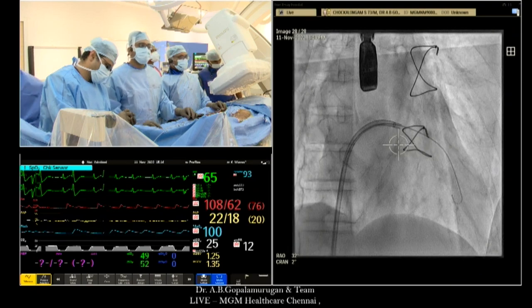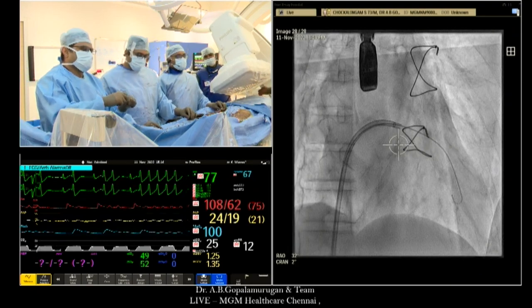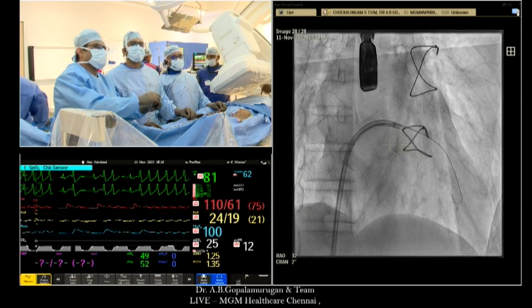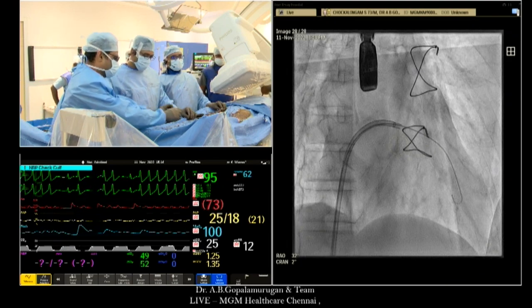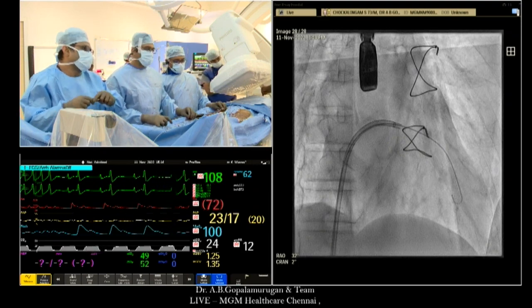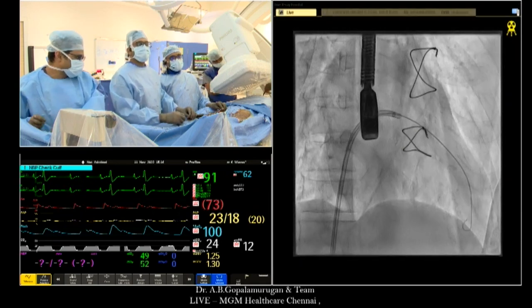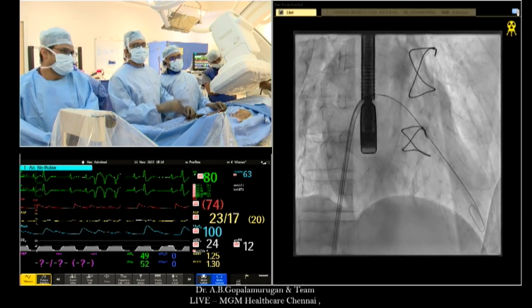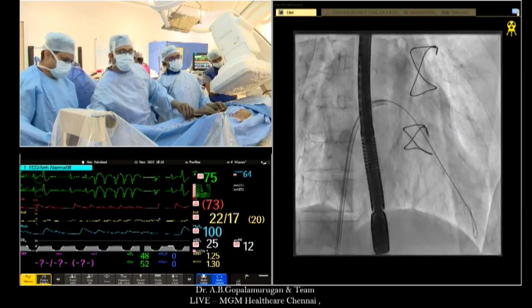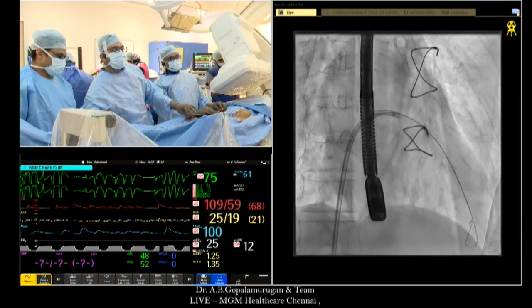And future will be hologram. We are talking about hologram and fusion imaging. So on the CT scan, if you have a GE machine and the GE cath lab, you can fuse both the images. So without much fluoroscopy, you can cross the septum with the guidance of TE. Also you can enter into the mitral valve with the hologram, like if you have a virtual image in front of you. That case has been shown in TCT 2022. So these are some innovative thoughts.